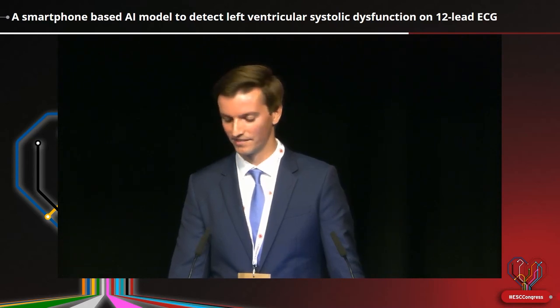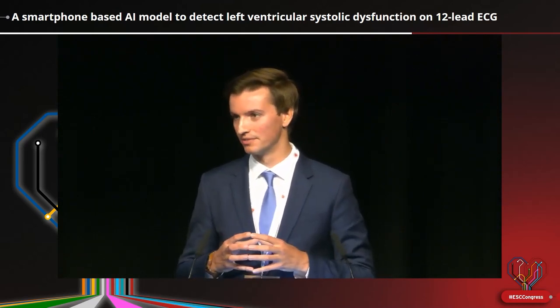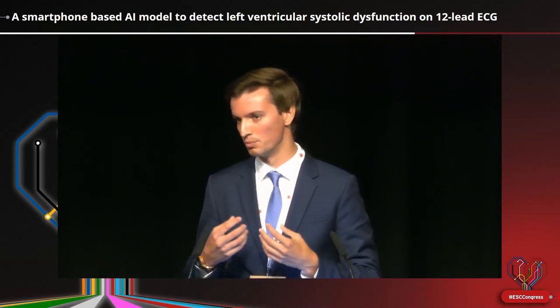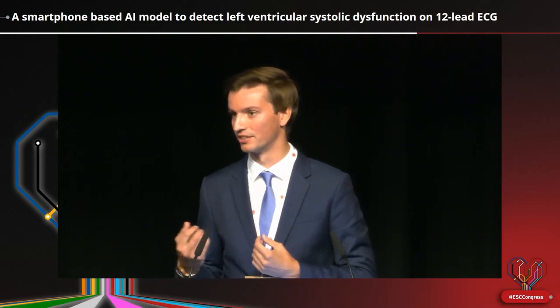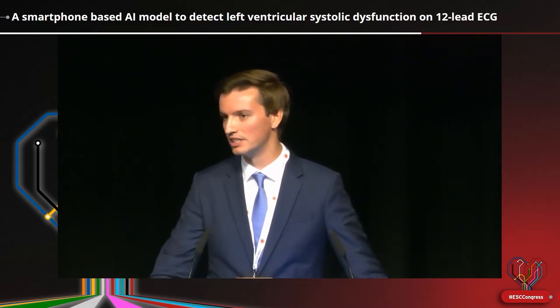Yeah, that's an excellent question. So we know that this AI model is now capable of detecting reduced LVEF. In the current setting, we would aim to use it as a sort of screening tool to identify those patients who would benefit from a referral for an advanced echocardiography. But we can also use it as a screening tool to maybe reduce echocardiography in patients who don't need a routine echo.